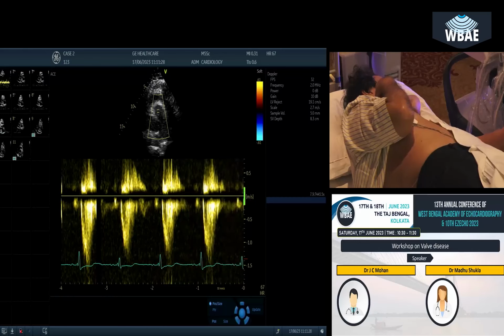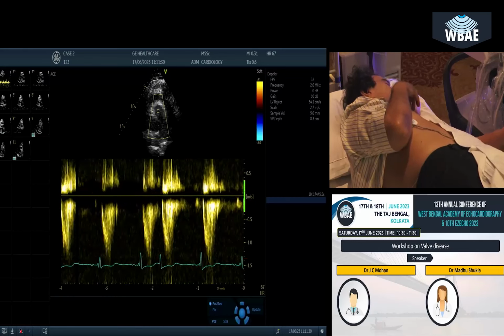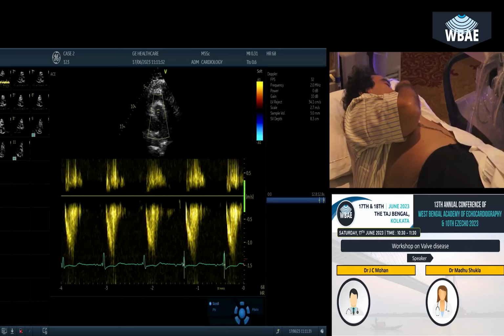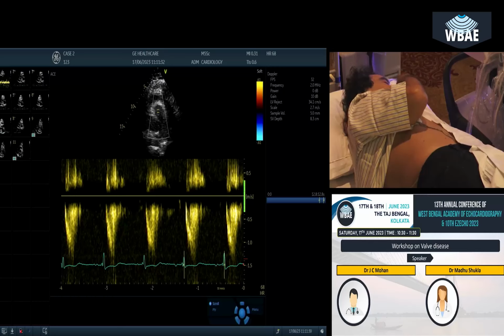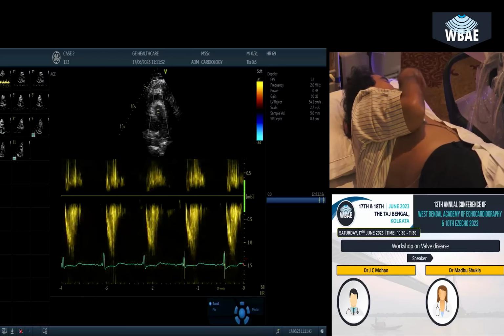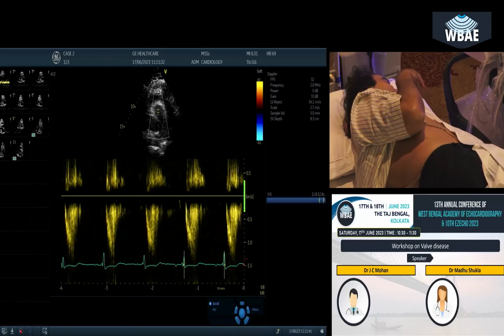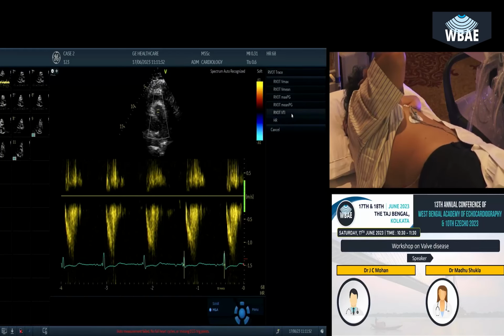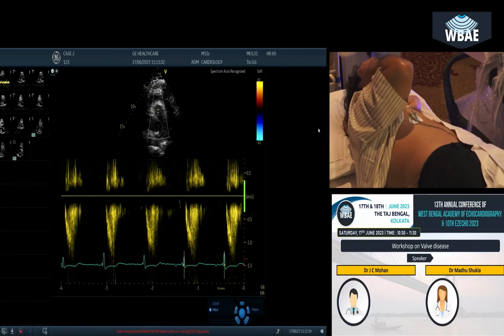Scale increase, and this you have to, yes, this one is okay. I'm not too sure actually. I would find it hard to find out where to put the marker. Okay, what we'll do is we'll put it on the last point and see how much the pulmonary ejection time is. Is it okay? All right, just show me this. And now measure. There is too much of reject time. But that's okay.